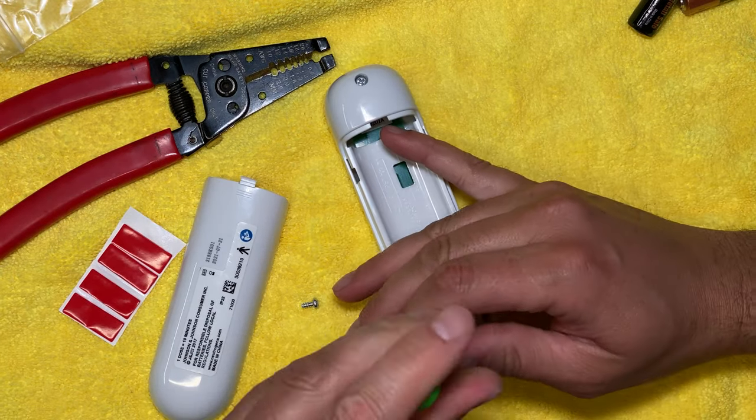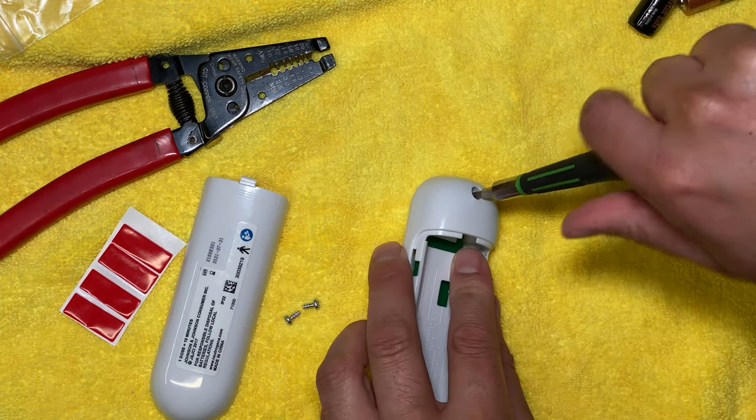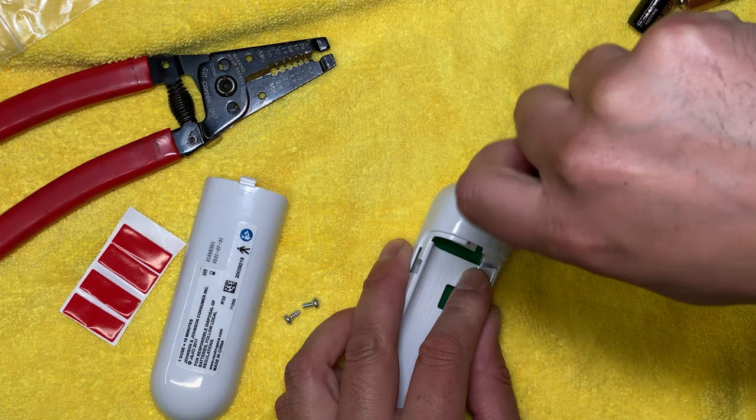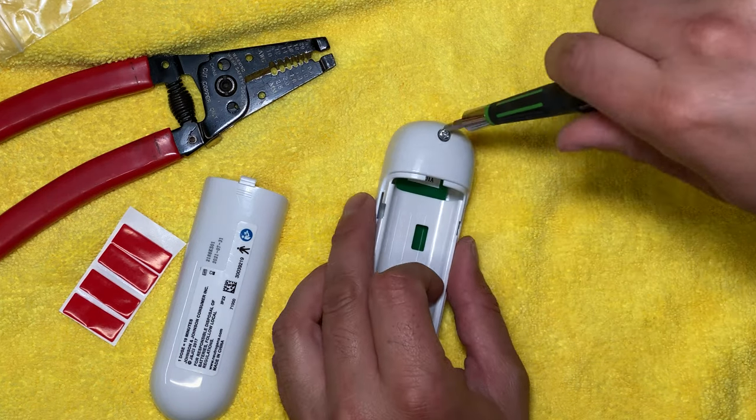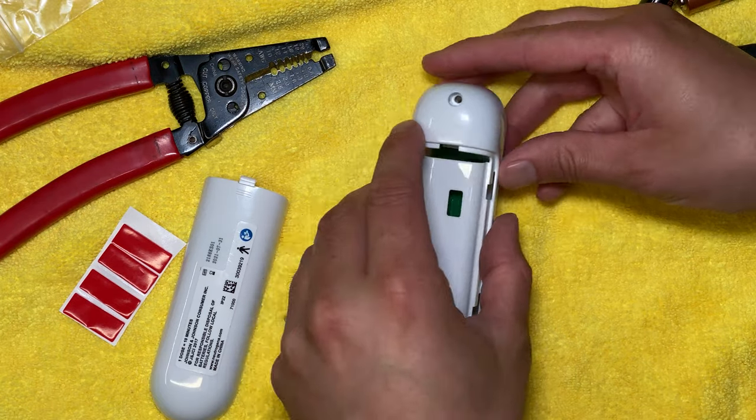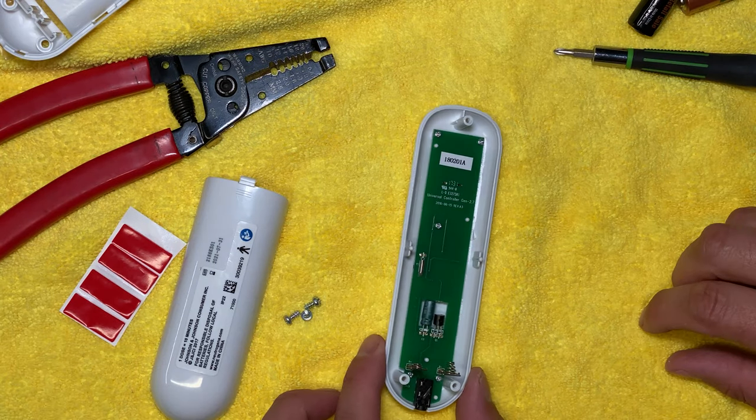So as you can see we already removed the battery cover and the four AA batteries and now we're using a screwdriver to remove the three phillips head screws for the casing. Once those are removed this white plastic casing will split in half and you want to be gentle here because there are some battery terminals underneath that you don't want to bend.